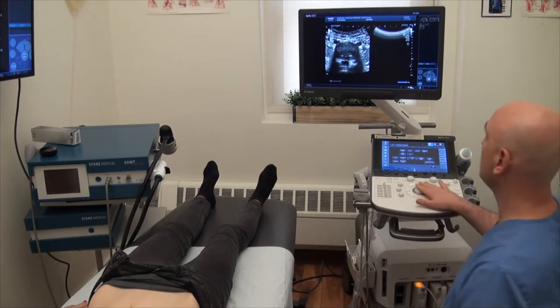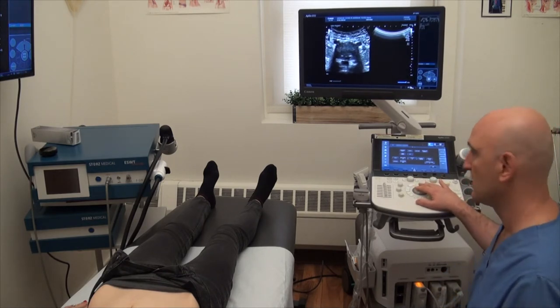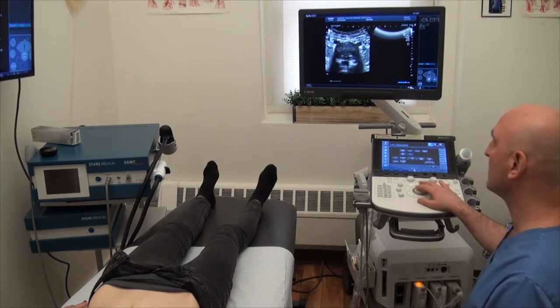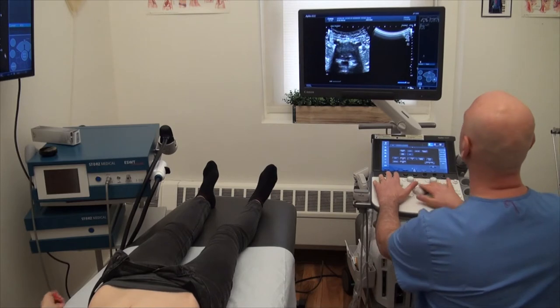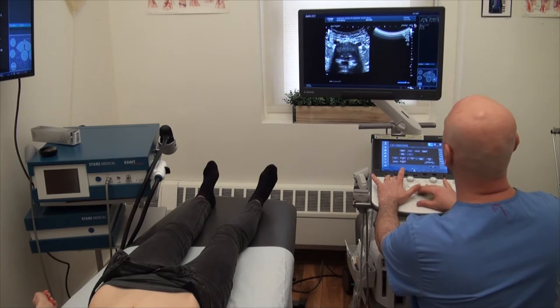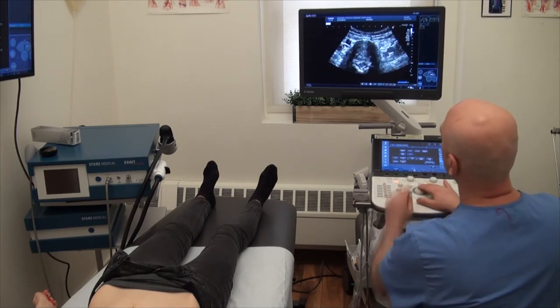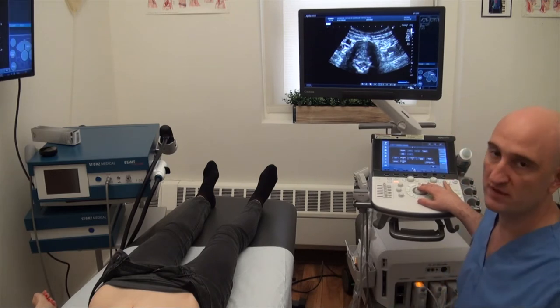The reason I wanted to record this video is because I had a patient who came in with sciatica — pain radiating to the buttock and the leg — and I imaged the patient. This is what we saw. Let me just shut off the light.